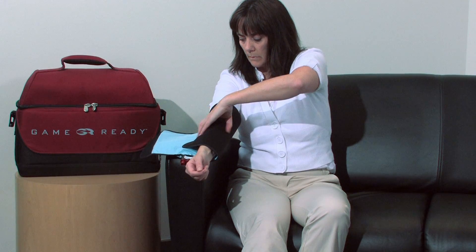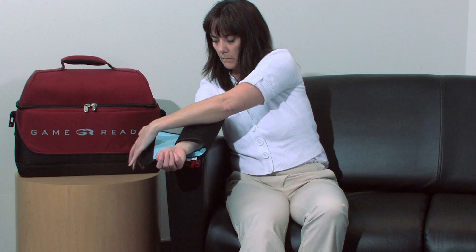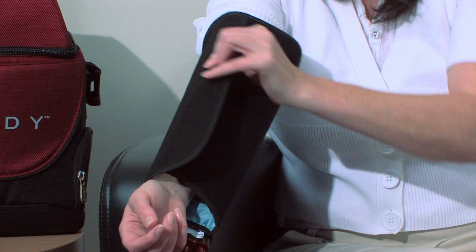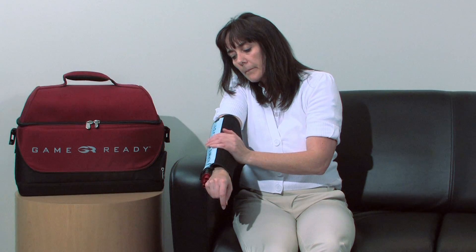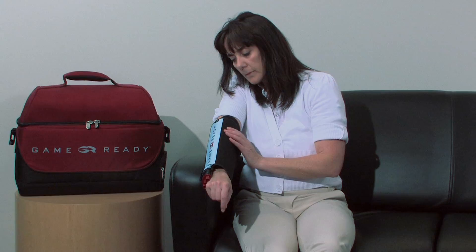Position your straightened arm on top of the wrap and secure the wrap snugly around the elbow. Always apply the wrap snugly against the body with no wrinkles or creases, allowing water to travel throughout the entire wrap.